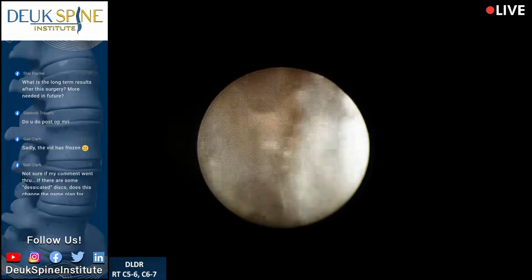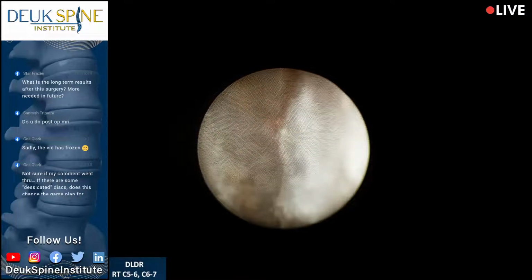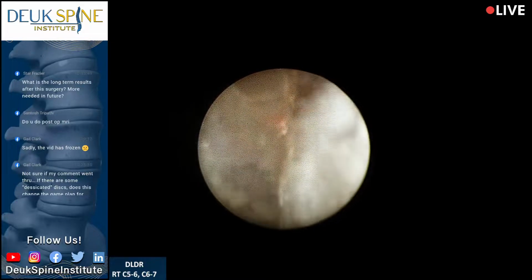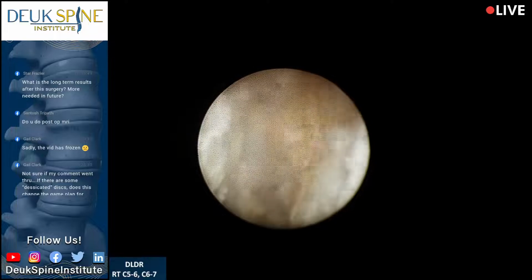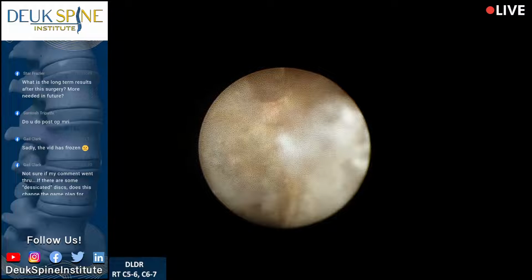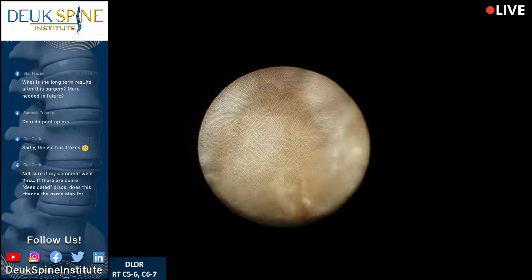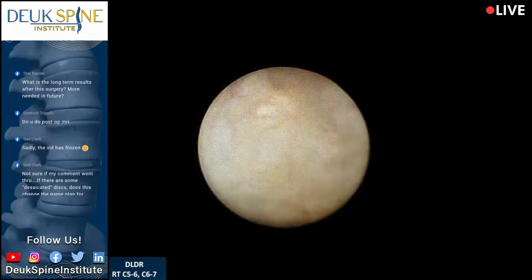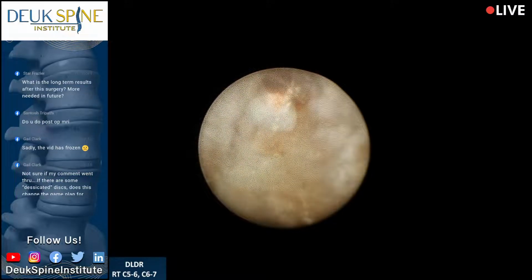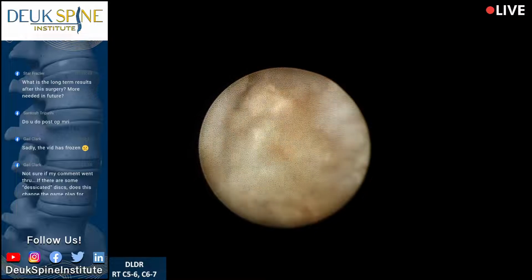This surgery works for bone spurs, herniated disc, degenerative disc disease, stenosis, spondylosis, bulging discs, ruptured disc, protruded disc, slip disc. So many different names to describe really the same thing. This part here is stenosis or narrowing. Once again, you can see the fibers of the PLL.